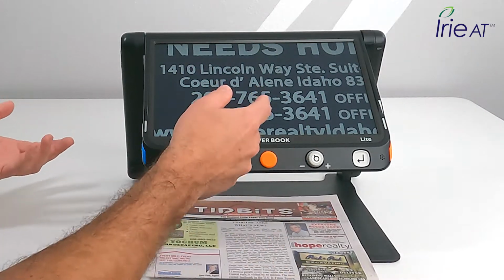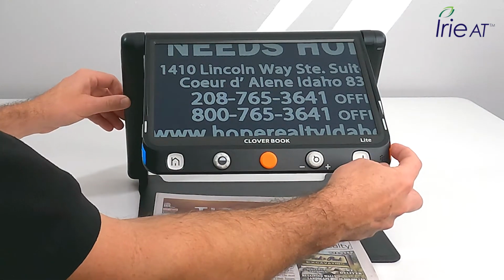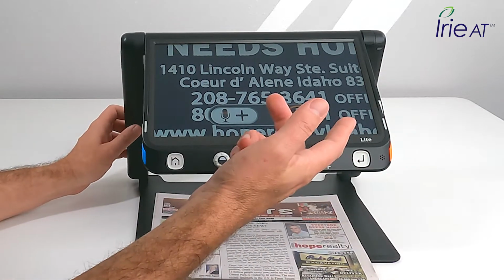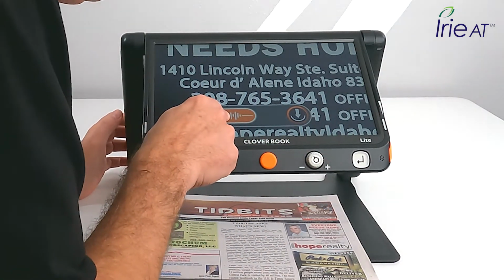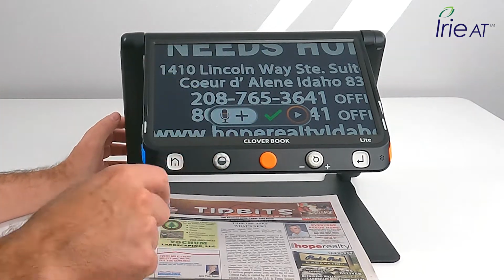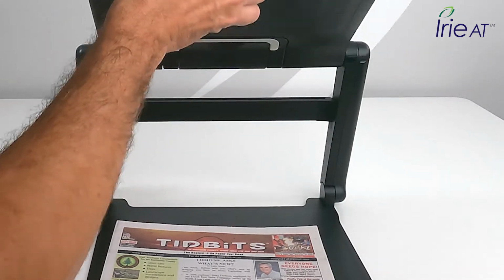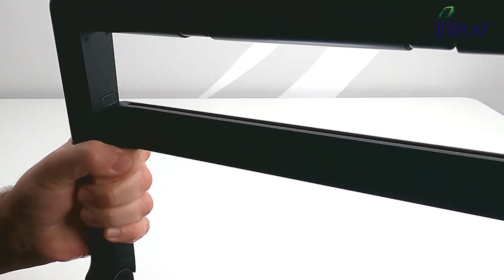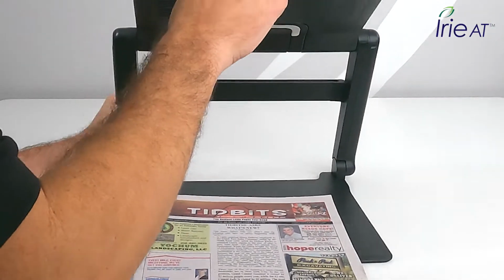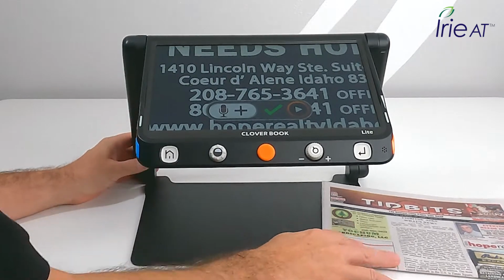But let's say there's a recipe I want to save. So what I'm going to do is hold down that freeze button. Image saved. And it's going to save the image. And I can even put a voice on here. This is my favorite recipe, Yahoo. And it'll play it. I'm going to hold that up to the camera so maybe you can hear it because it's on a low volume. This is my favorite recipe, Yahoo. Not sure you can hear that. I can crank that up so you can actually hear it. But I'll show you when we go through the menu.